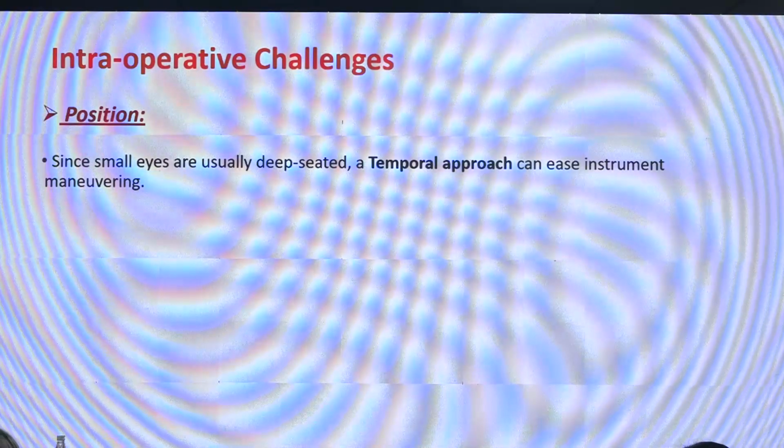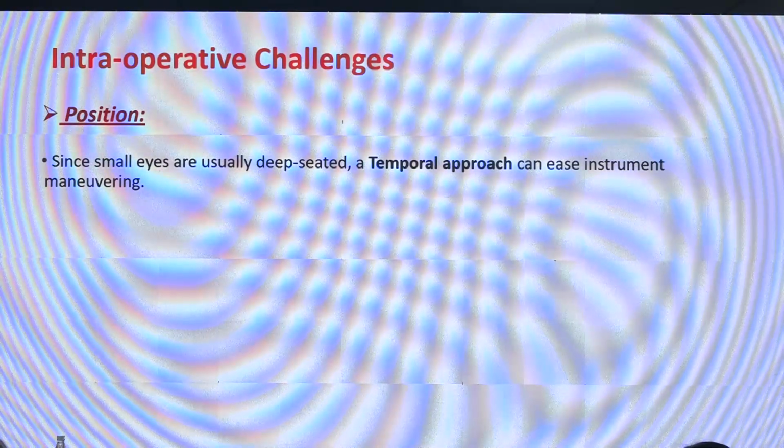Coming to the intraoperative challenges, first thing is surgical position. Since small eyes are usually deep seated, a temporal approach is preferred because it will ease instrument maneuvering rather than a superior position.